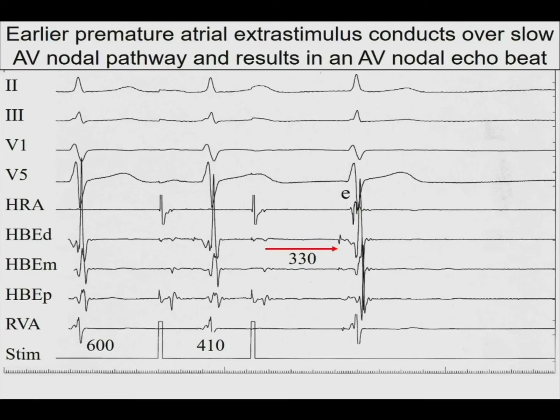And you have to be very careful. A perfect example is when you're monitoring VA conduction with junctional ectopy when you ablate a slow pathway. And you'll hear about that, but when you look for junctional ectopy, that's what is necessary to make sure you're ablating the slow pathway. You can't monitor AV conduction, so you, by default, monitor VA conduction. So you have to have a great atrial electrogram. If you have an A and a V and you get a junctional rhythm, you may not be able to determine that. So it applies to many different scenarios.